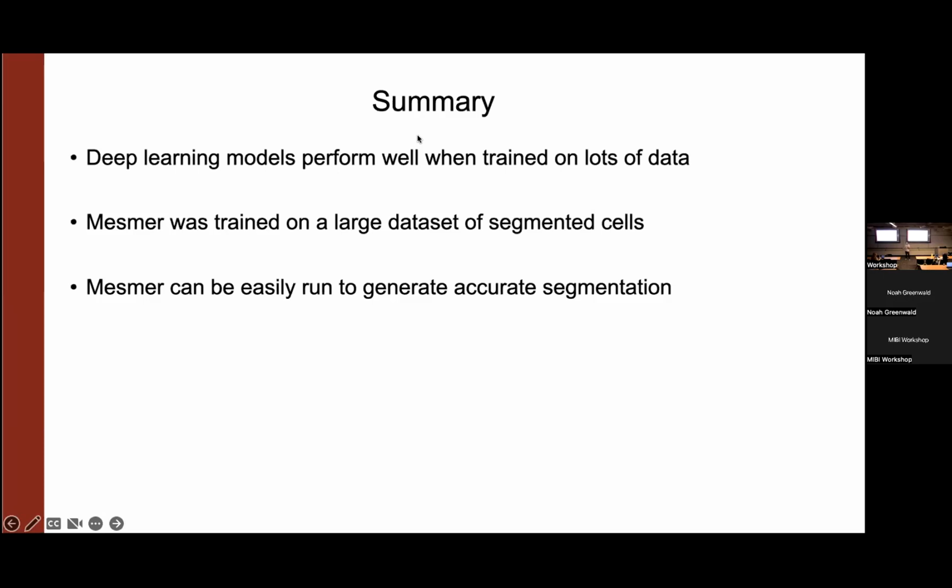But there's a lot of subtleties involved in how you actually do fine tuning. But that would be the approach I would take if I really needed to get these cells: hand annotate a smaller amount, not millions, but thousands or tens of thousands of cells, and then briefly fine tune the algorithm on those.